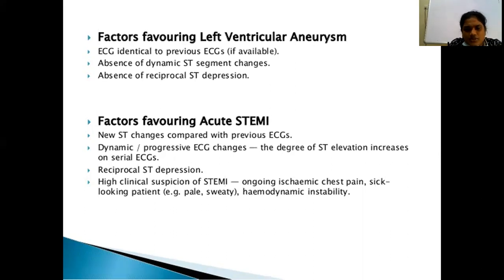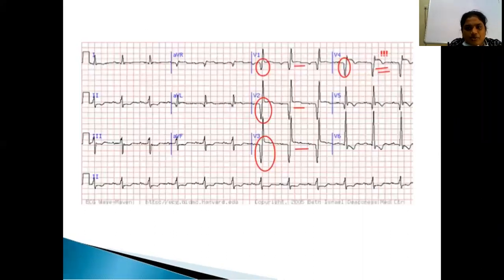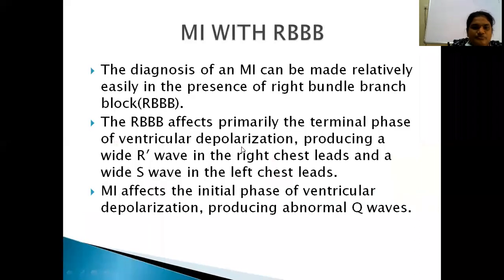And the clinical symptoms can also be present in the acute MI. So here, this is the ECG. Still we are able to see the ST segment elevation, but the T wave is not that much, and the Q waves are completely formed. The T waves are almost flattening, or it is normal. Then the myocardial infarct with RBBB.